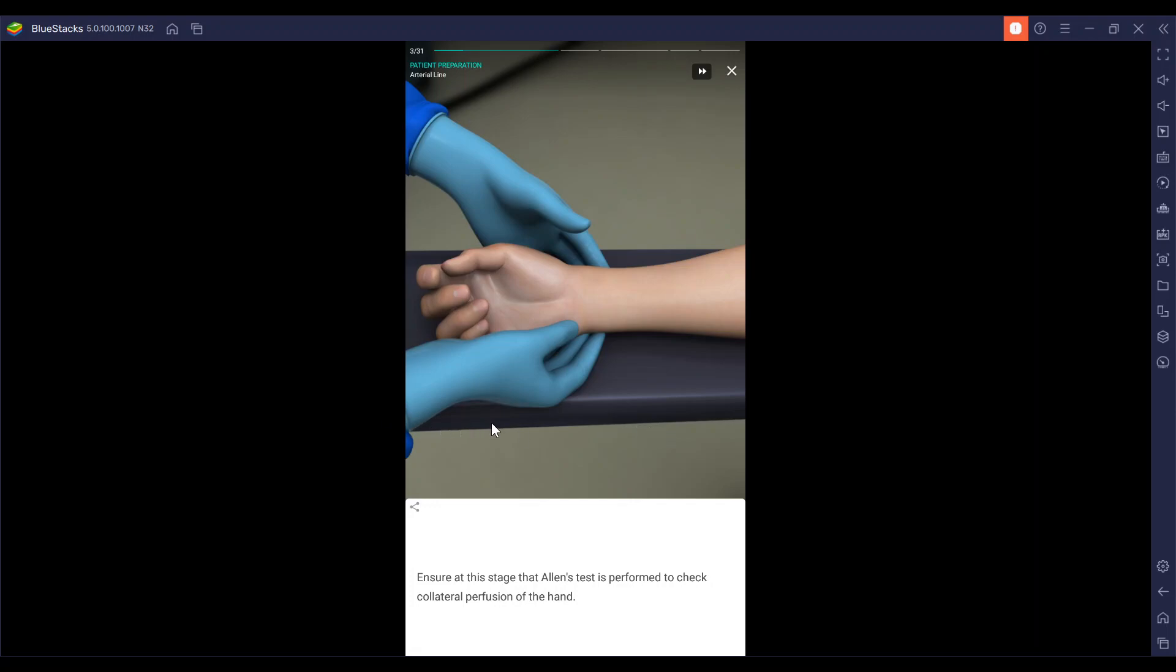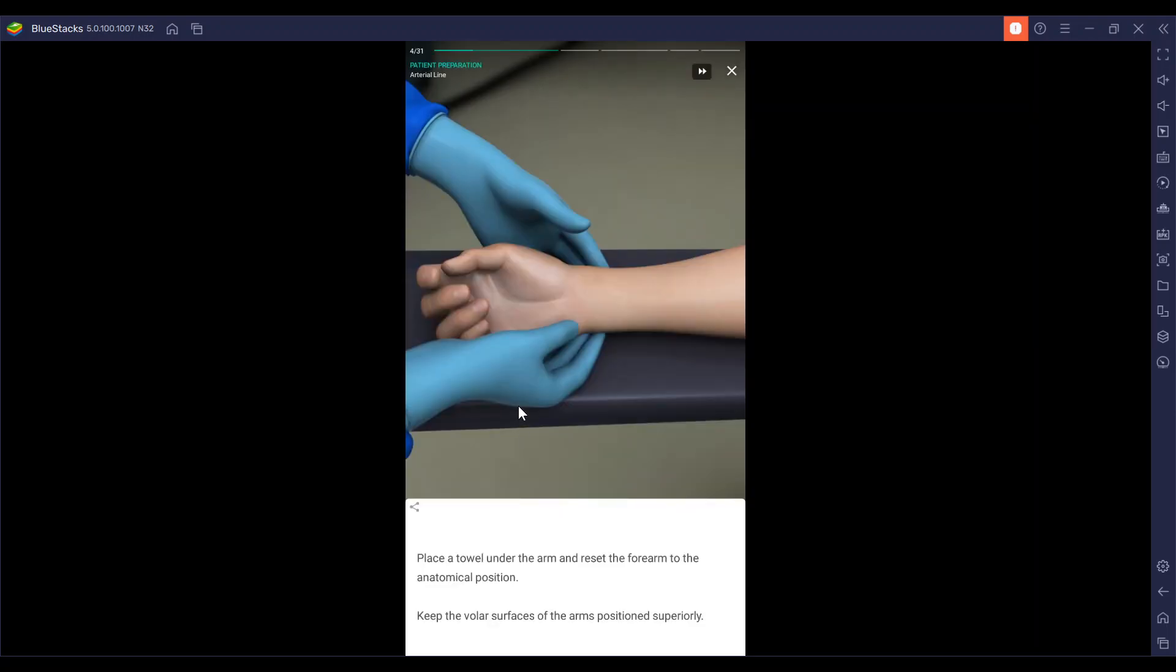We're going to place a towel underneath the arm and reset the forearm to the anatomical position. This is to keep the volar surfaces of the arm positioned superiorly.